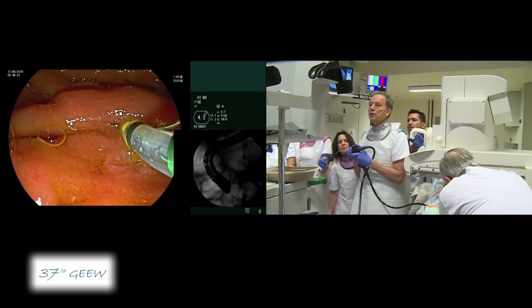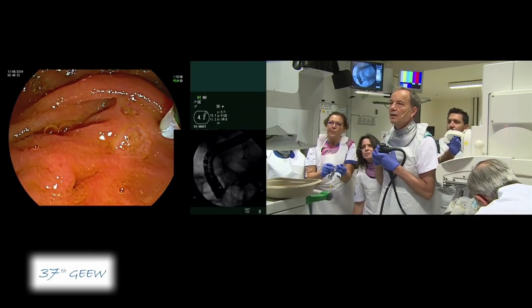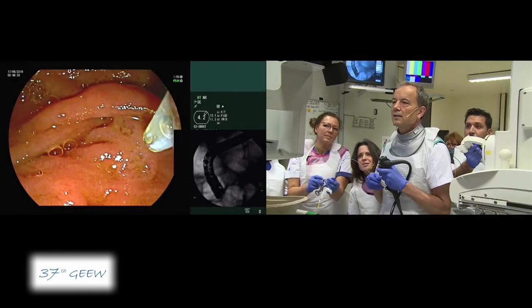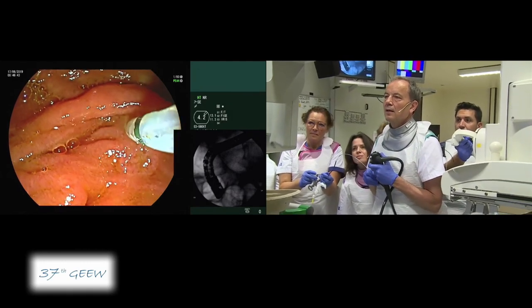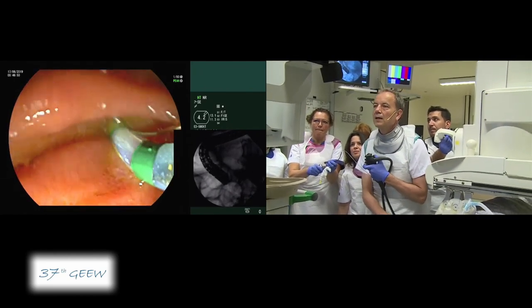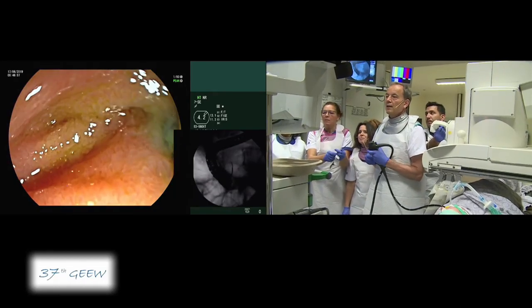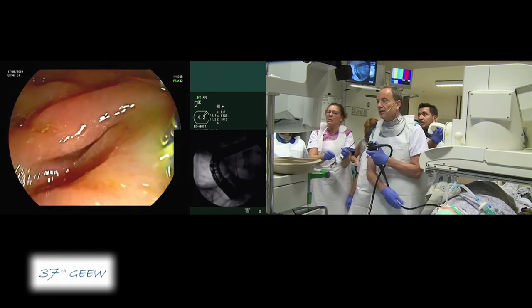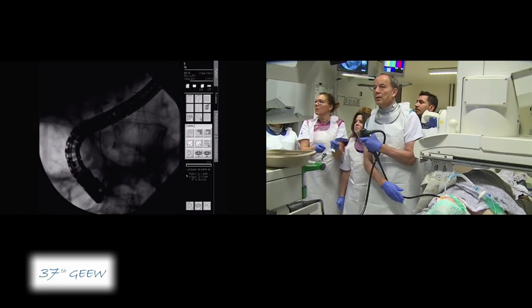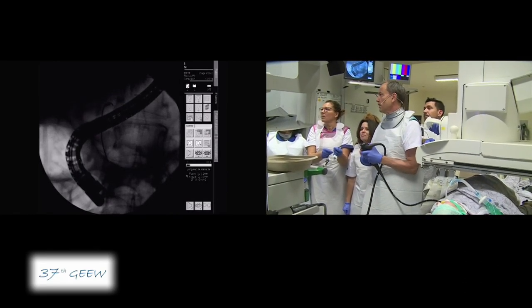As you can see, I very smoothly pushed it in this direction. We are obviously in the bile duct. Always, before you start your cannulation, have a good view of the side of the papilla, because here we really have two different orifices.